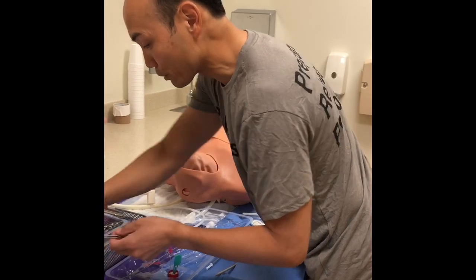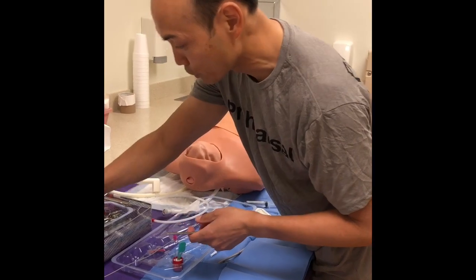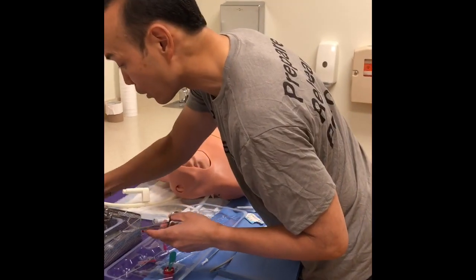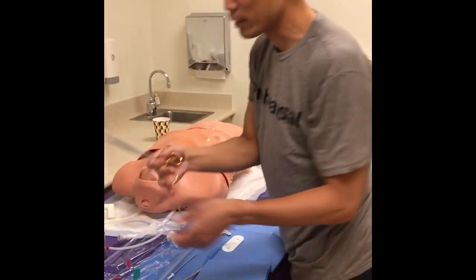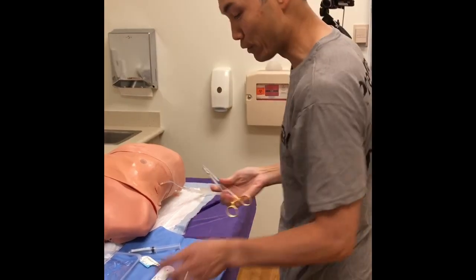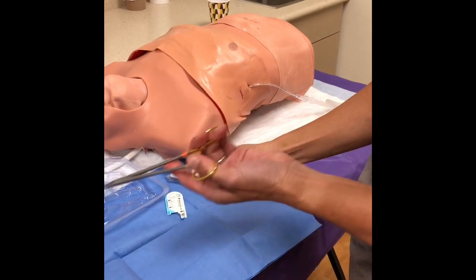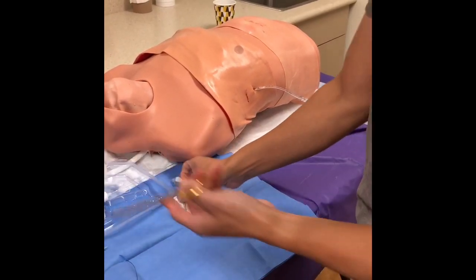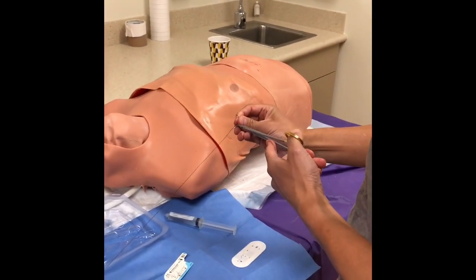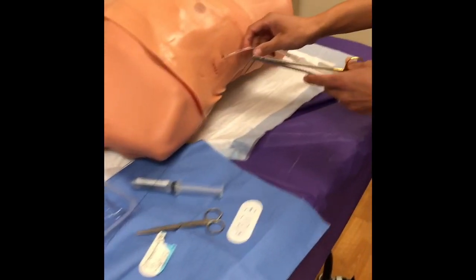Find the right instrument for securing. A Kelly clamp is clearly too big — that's for an open chest tube. The instruments from the kit are fine. For these smaller tubes, you don't need large sutures — 0 silk is fine. There are a lot of different ways to secure it.